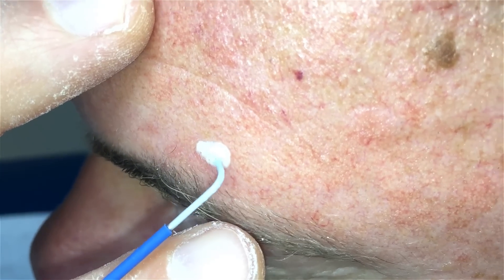And then you'll have a little blister there. You'll get frostbite — tomorrow morning you'll see it. It's still white but it's going to thaw out. We recommend just putting a little bit of aquaphor — we'll give you some — just to keep it moist until it's scabbed over, like your arm already is.